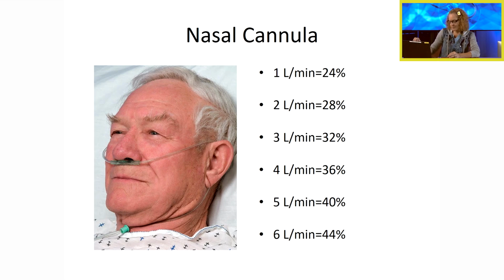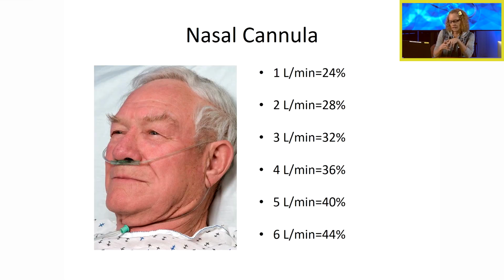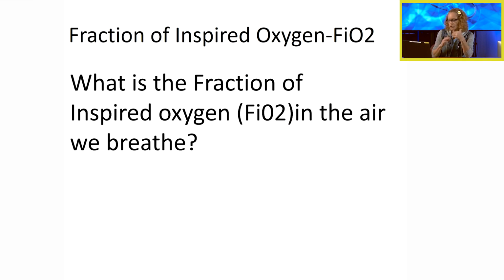patient is getting. Now, this is called FiO2. If you hear anybody talk about fraction of inspired oxygen, or FiO2, that is what they're referring to when they are saying the patient is on 4 liters, 36%, right? So, I'm going to ask you a question.